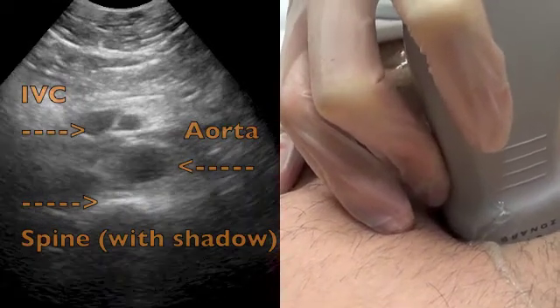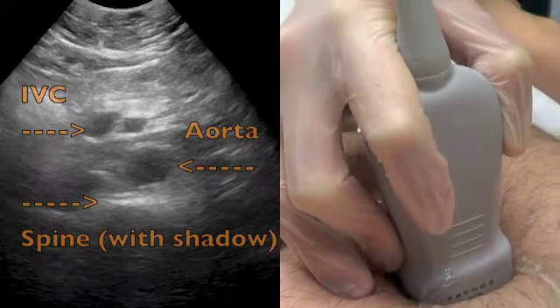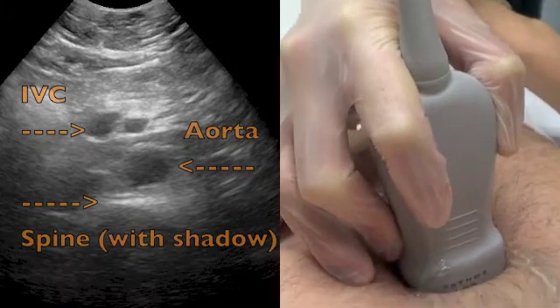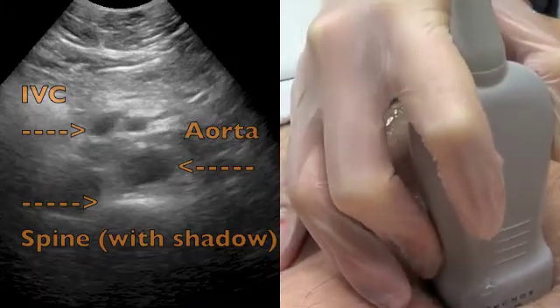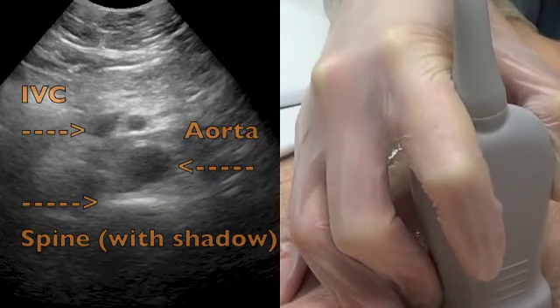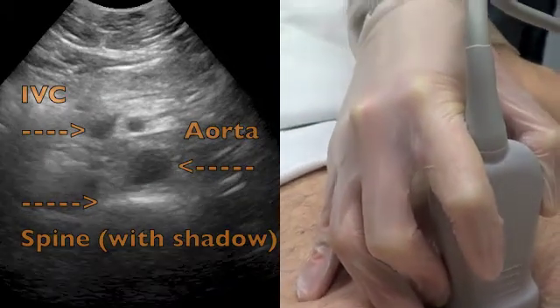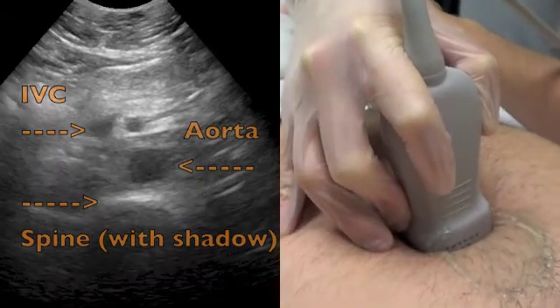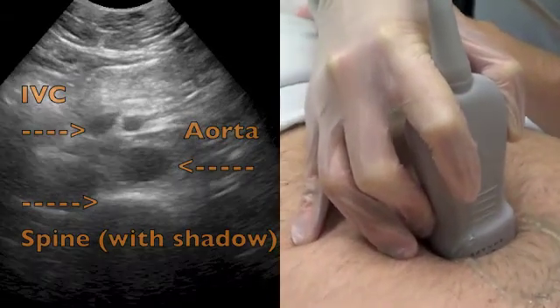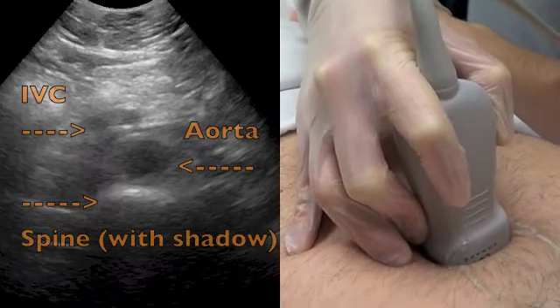I'm going to find the spine, which is going to be a bright white, hyperechoic curvilinear line like an upside-down horseshoe. That's the spine, which is our landmark for the aorta — the aorta being on the right side of the spine, patient's left, right side of the image. And then the IVC is on the patient's right, which is on the left side of the image on the screen.